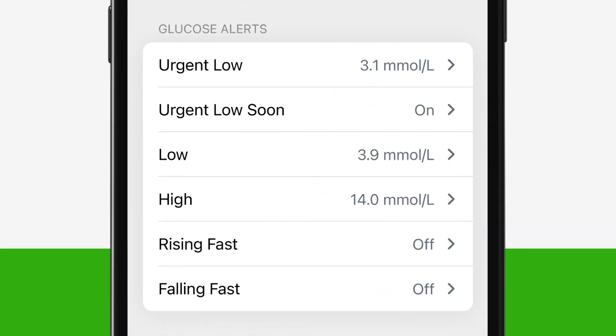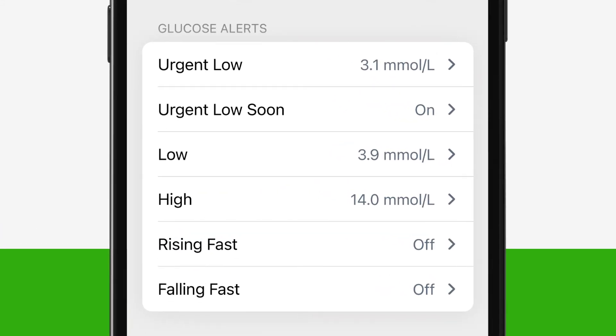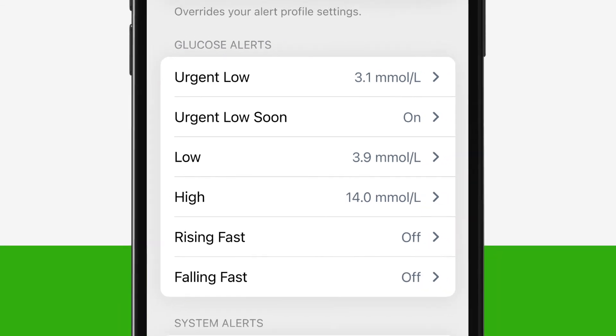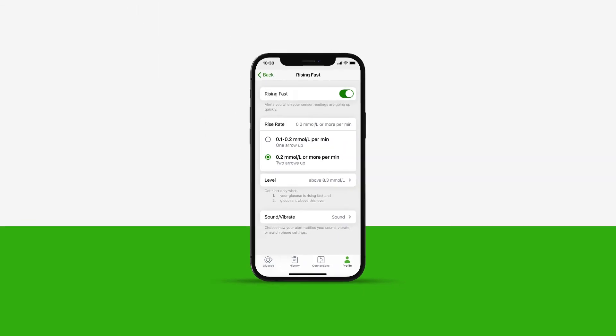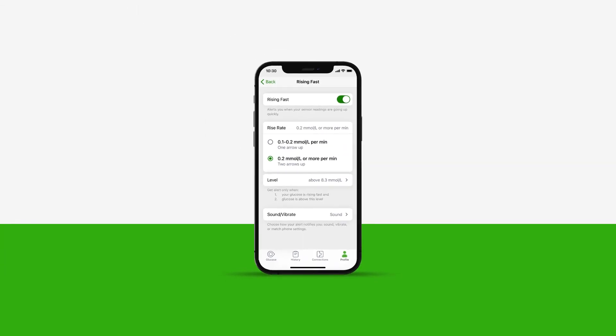The two final glucose alerts on the G7 device are the rising fast and falling fast alerts. When turned on, these alerts will alert you when your sensor readings are either going up or down quickly. You choose the glucose level change rate: 0.1 mmol per litre per minute or 0.2 mmol per litre or more per minute.